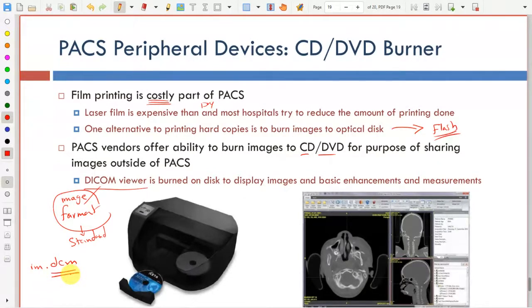You can even include a 3D volume in one file. It's much more versatile. That's why it's definitely an image format, but it's more than an image format. It's governed by a whole standard because it has a lot of parts and a lot of utilities.